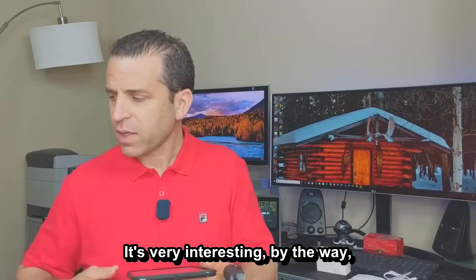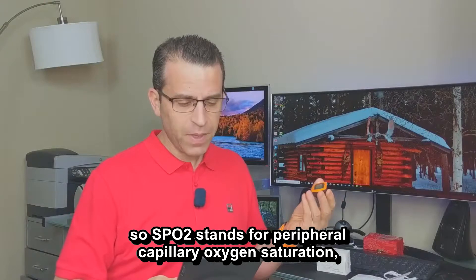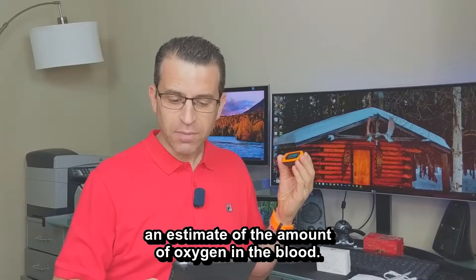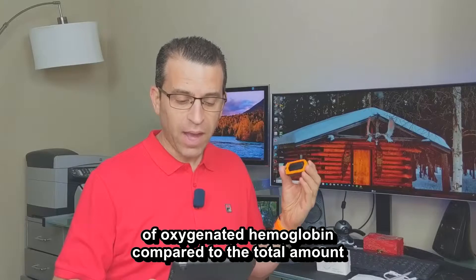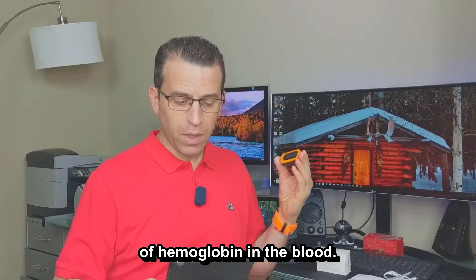It's very interesting learning more about the product. SPO2 stands for Peripheral Capillary Oxygen Saturation — an estimate of the amount of oxygen in the blood. More specifically, it is the percentage of oxygenated hemoglobin compared to the total amount of hemoglobin in the blood.